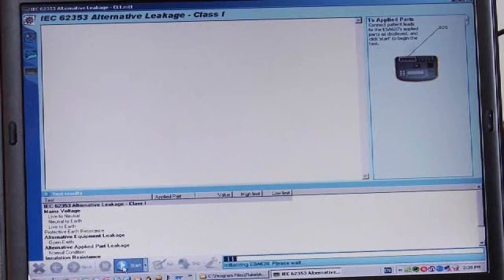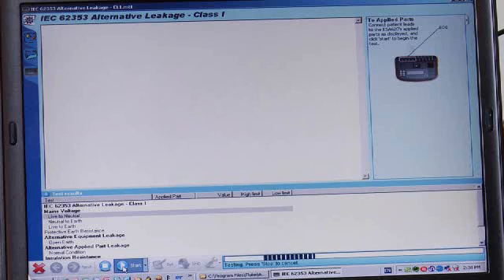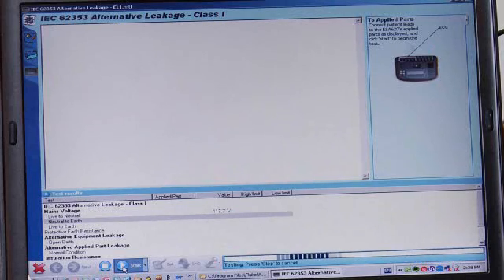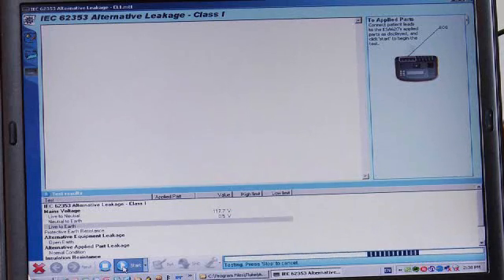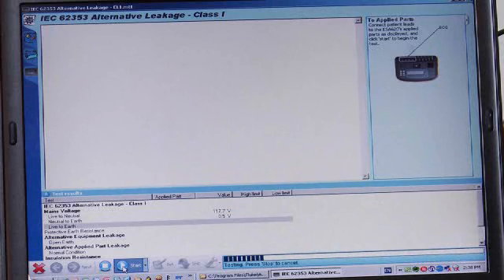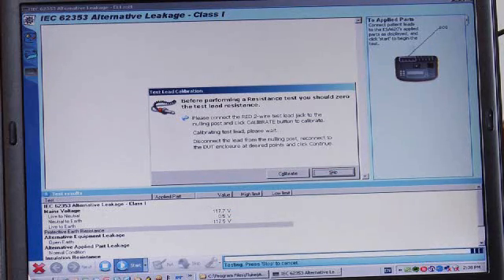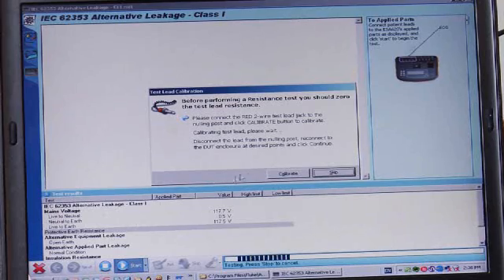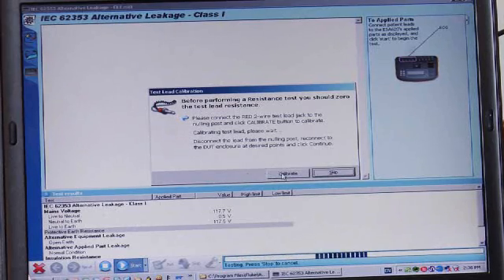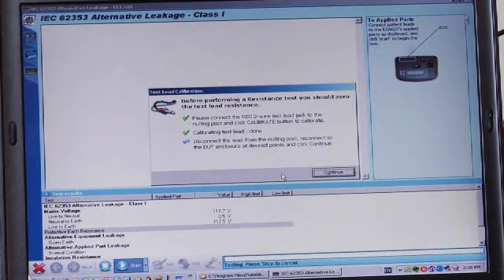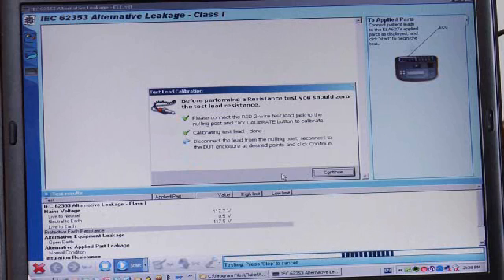The test procedure will communicate with the test instrument and configure it for each test that needs to be done. It will also pause and let us zero our test lead so that we get rid of any resistance in the lead wire itself, so we're reporting only the resistance of the ground wire of the medical device.